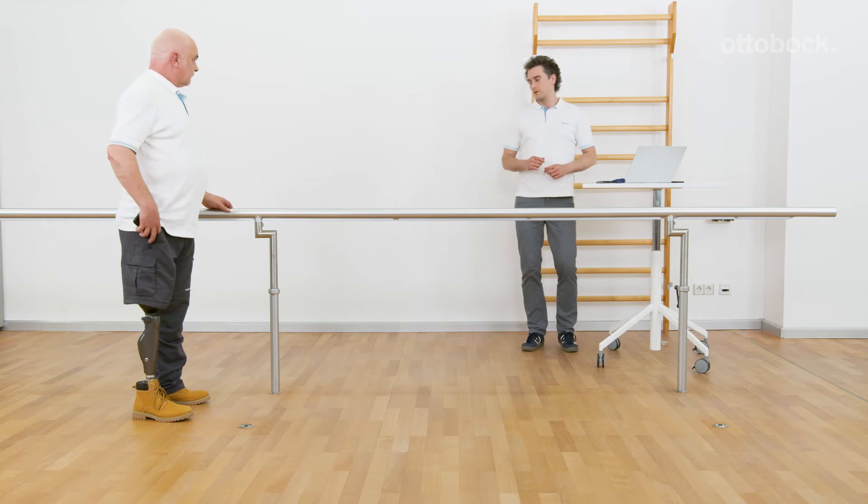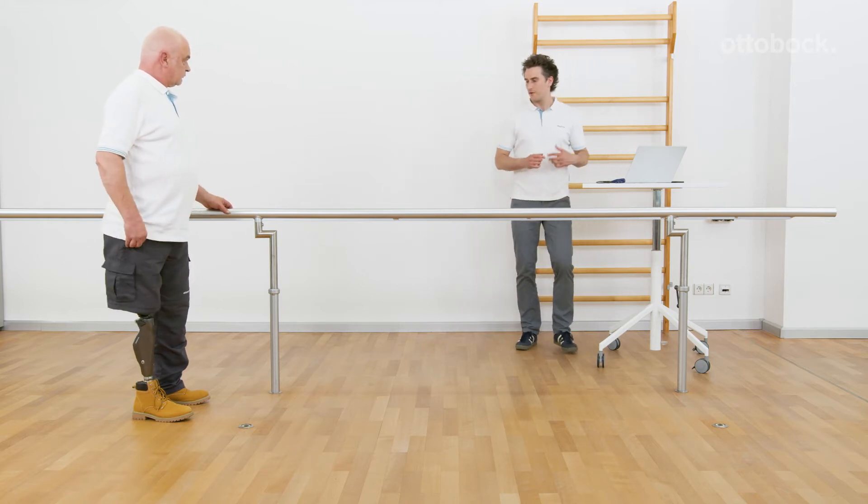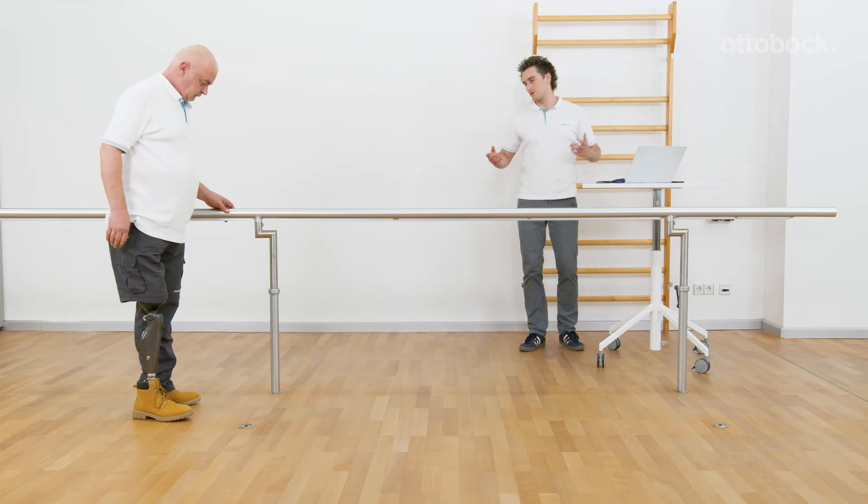Ask the user to walk on even ground and wait for the beep from the knee joint to acknowledge a successful stance release.